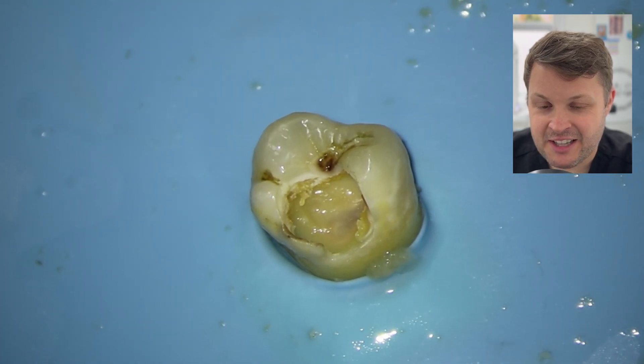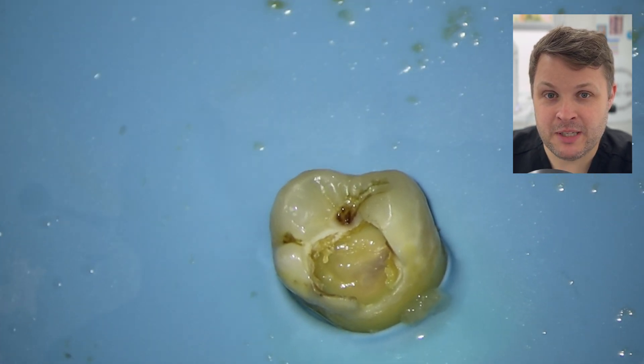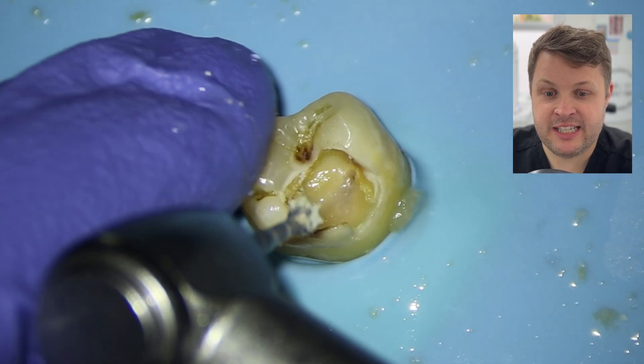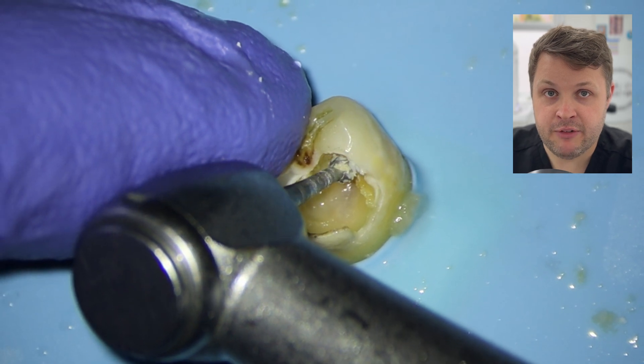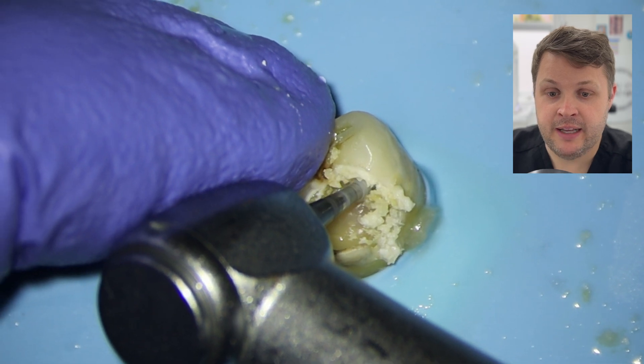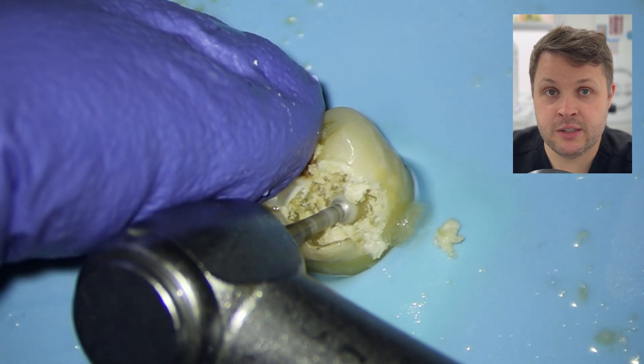We can see here that the pulp has been exposed. And given the fact that the patient was having severe pain with this tooth, and given the fact that on the x-ray there was a chronic apical periodontitis — in my book, that tooth needed a root canal.